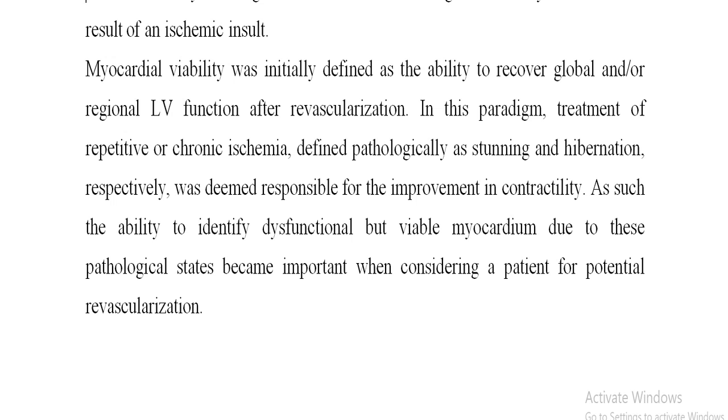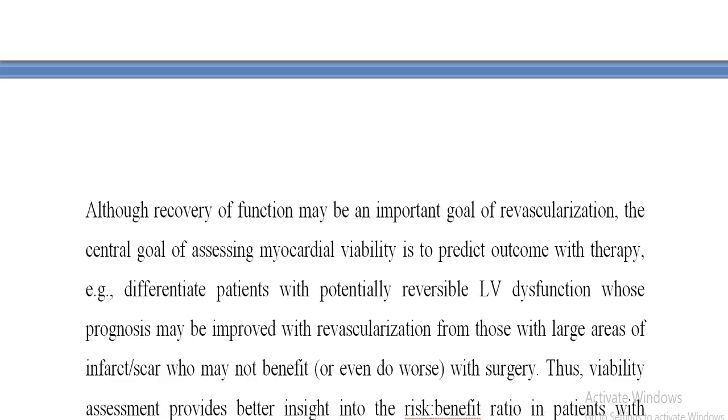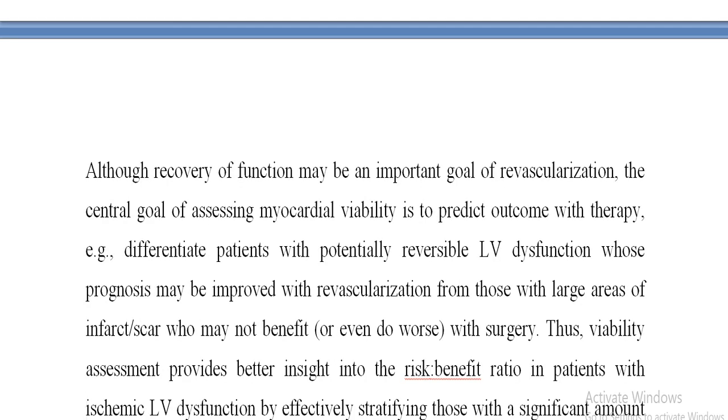Although recovery of function may be an important goal of revascularization, the central goal of assessing myocardial viability is to predict outcome with therapy, for example, differentiate patients with potentially reversible LV dysfunction whose prognosis may be improved with revascularization from those with large areas of infarct scar who may not benefit, or even do worse, with surgery. Thus, viability assessment provides better insight into the risk-benefit ratio in patients with ischemic LV dysfunction by effectively stratifying those with a significant amount of viable myocardium who are at increased risk if treated medically from those who would be at high risk with either treatment.